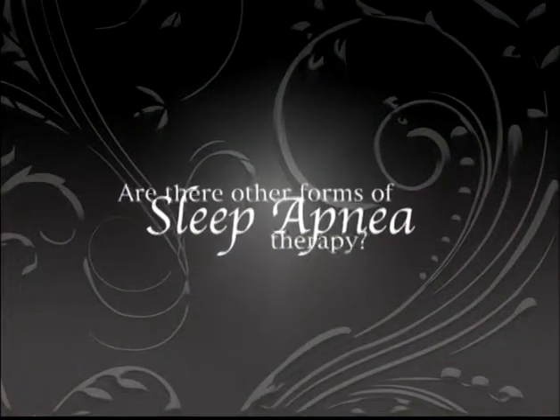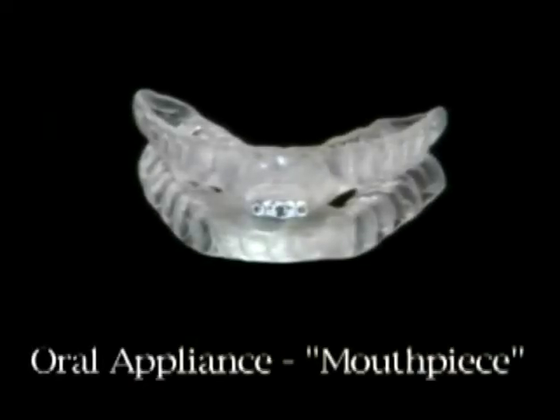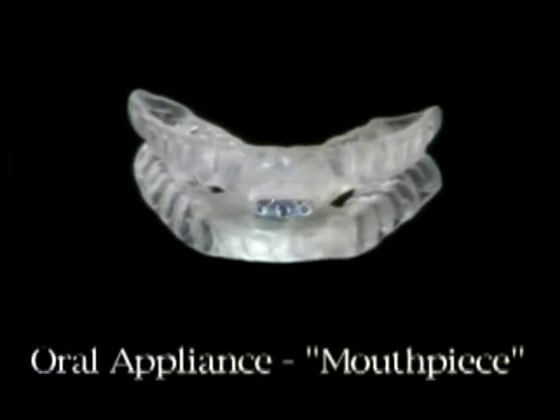Other treatment options would include an oral appliance, which is a mouthpiece that fits in the mouth. Now it's not a standard mouth guard, it's a mouthpiece that works like braces and has a crank on it and actually works by pulling the jaw forward. So if you pull the jaw forward enough, it opens up the airway and prevents collapse.